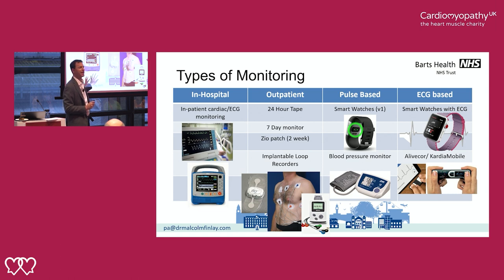And really that is for one purpose. The main reason for being wired up all the time is that if something disastrous happens, the nurse can run in and we can get a cardiac arrest team out and make sure a disaster doesn't happen. Self-monitors do not do that, or at least none really at the moment. And I guess ICDs, implantable cardioverter defibrillators, kind of have that role in the community, but that's where this sort of thing stops.